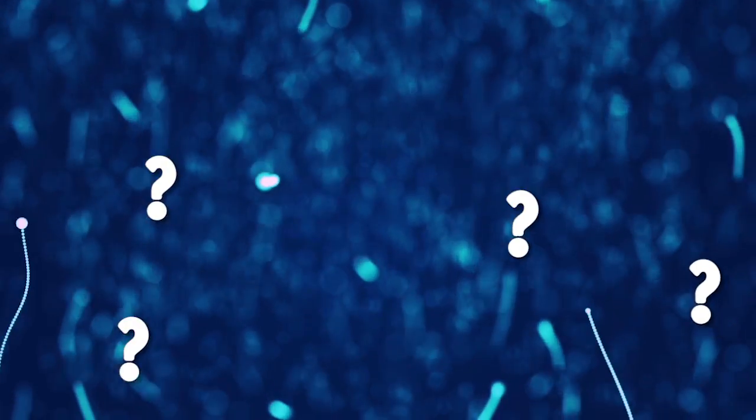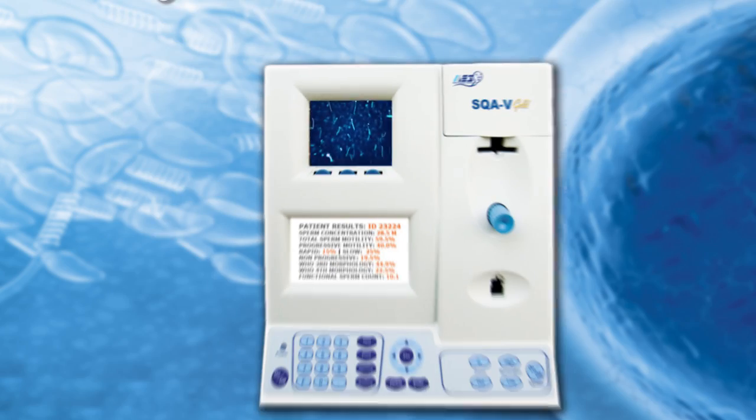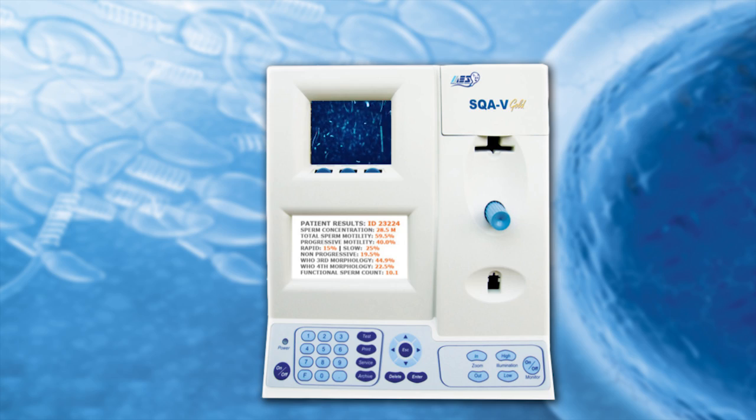Semen analysis is one of the most subjective and least standardized tests performed in the laboratory today. In the early 2000s, Medical Electronic Systems created the SQA line of automated sperm quality analyzers to address this challenge.